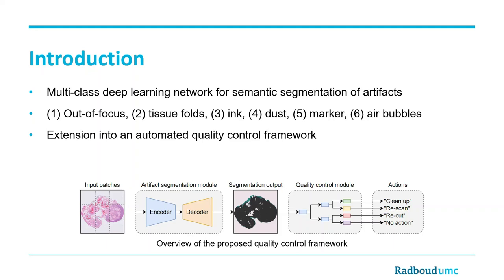To train the network we collected and annotated a diverse dataset that included multiple tissue and staining types, which makes our approach applicable to a wide variety of images. This deep learning network can be extended into a quality control framework that can automatically inform pathologists about the required actions to fix issues caused by artifacts.